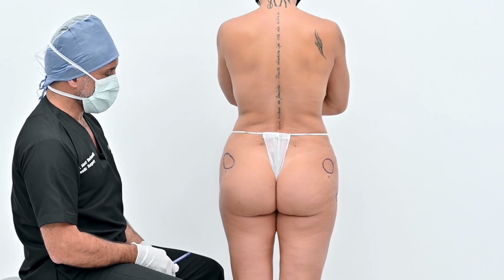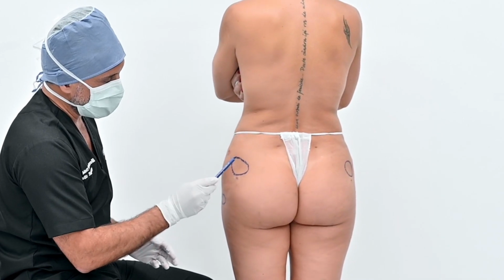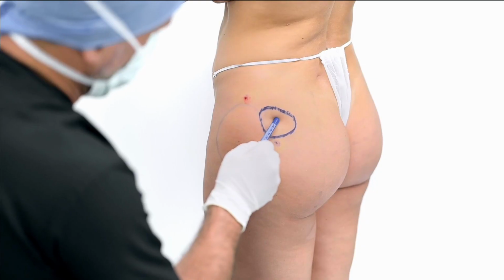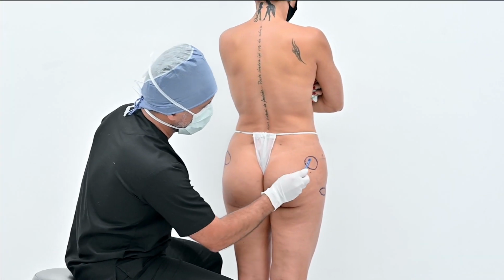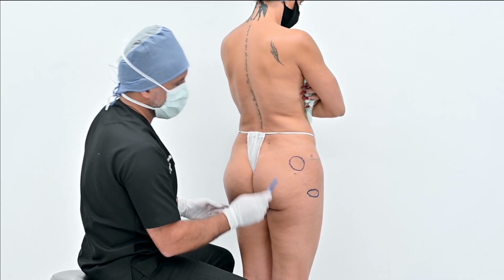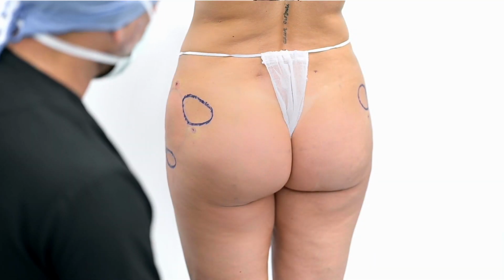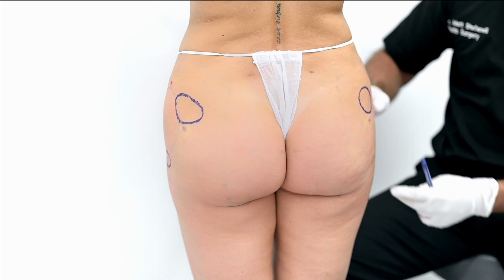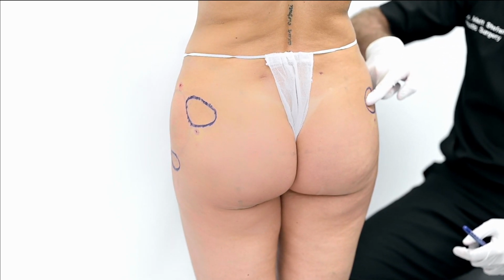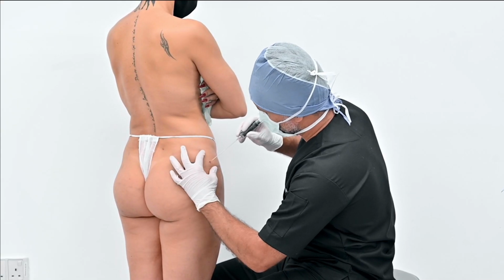So you can see here the plan for the touch-up. On the two sides, we will inject the transition zone higher and lower to the injection area. And same here. This zone and this zone to make a smooth transition zone. We will perform this injection in this position to be even more precise. So I would like now my nurse to come. And we are going to start with this side, for example. I will do this zone from this entry port. So let's start with this first zone from this entry point.